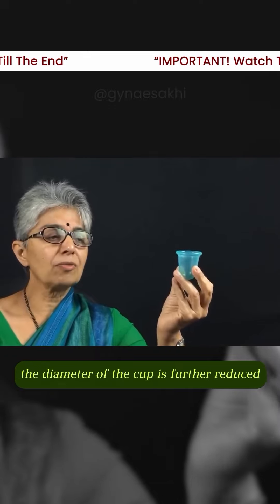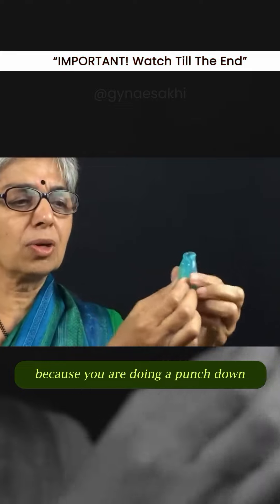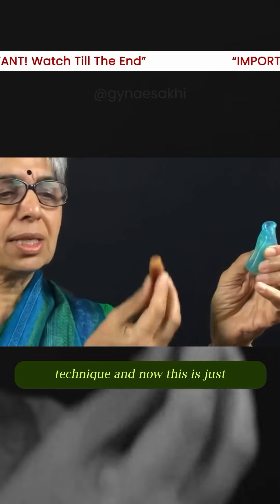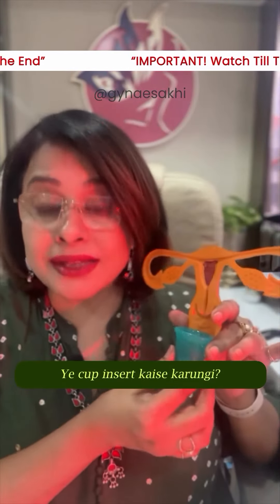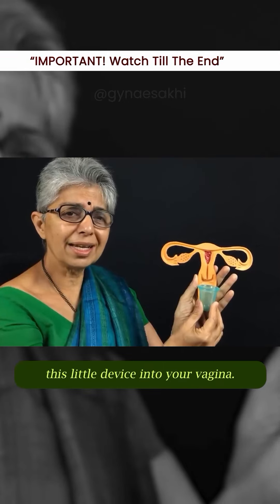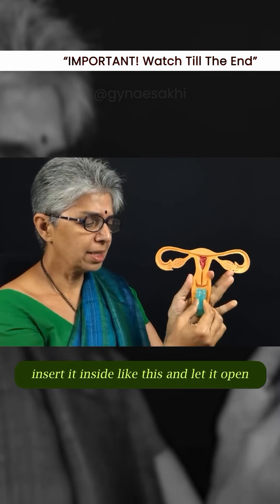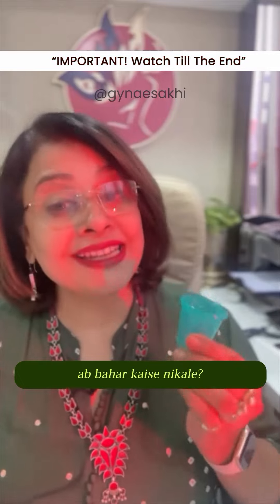When you insert the cup, the diameter is further reduced because you do a punch-down technique. This is just the size of a date. ये कप इंसर्ट कैसे करूंगी? Let me show you how to put this little device into your vagina — reduce the diameter of the cup and insert it inside like this, and let it open up inside the vagina.